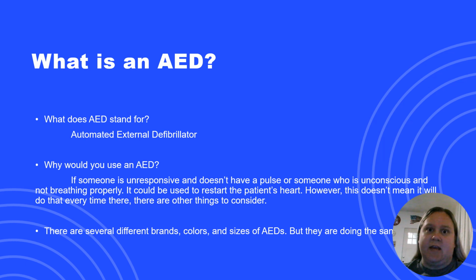But it's also safe to have it on just in case we need it, right? So someone's unresponsive and doesn't have a pulse, so we're going to put that AED on. It could be used to help restart the patient's heart. However, this does not mean that it will restart the patient's heart every time. So it's very, very important that everybody understands that.